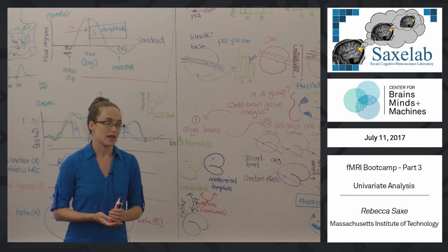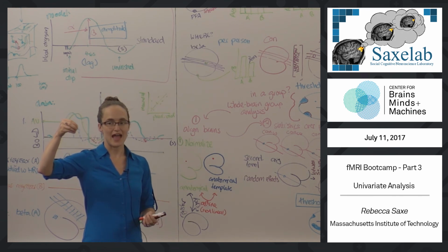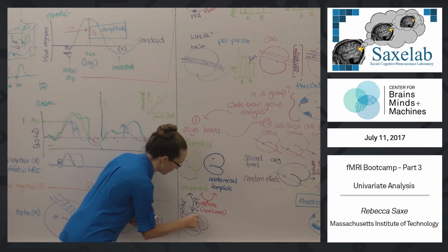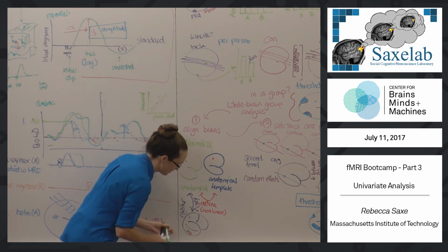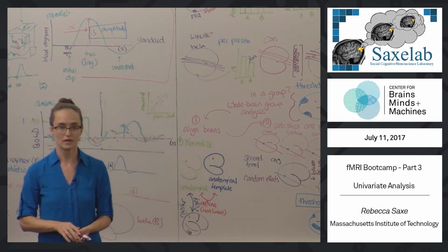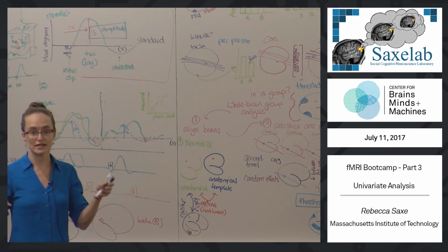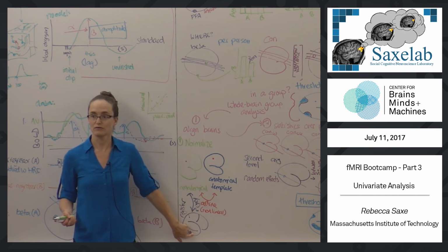That's right. It's because the exact location and size of functional regions varies across people. And it varies in ways that are not visible in the images that we have, right? So if you look at, for example, the sulcal markers, even if you know where all the sulci are, the exact location of the same functional region, even if it's similar, is different enough across people that the best alignment you can do based on what you can see in an anatomical image, sulci, gyri, the gray-white boundary, tissue structure boundaries, even the very best alignment you can get cannot perfectly get functional regions aligned.